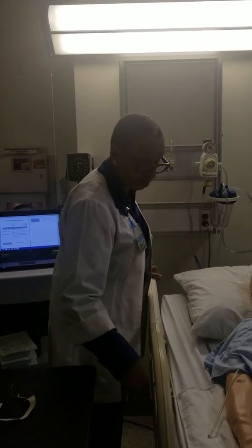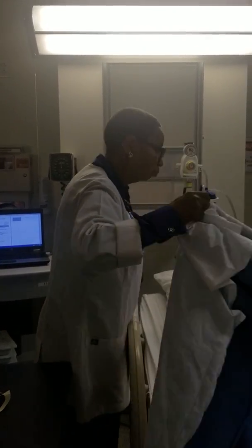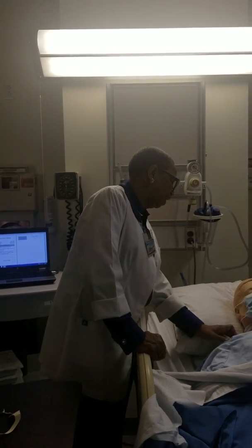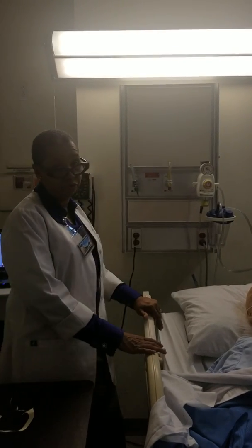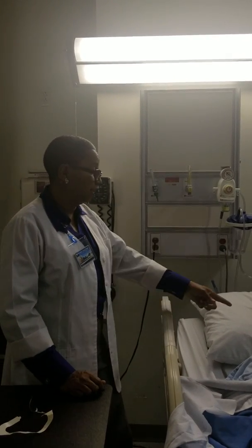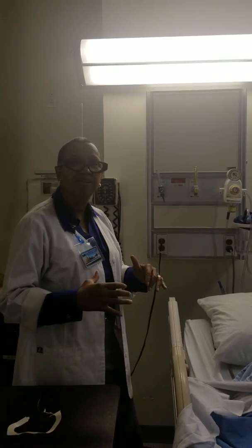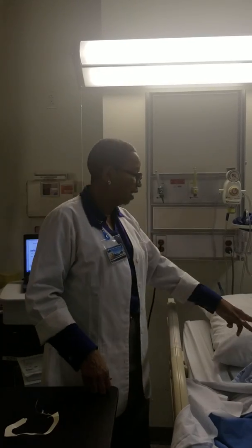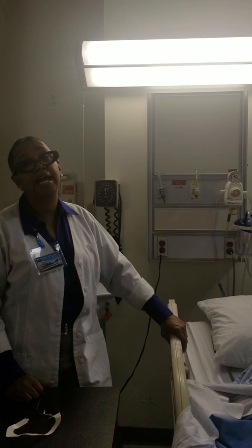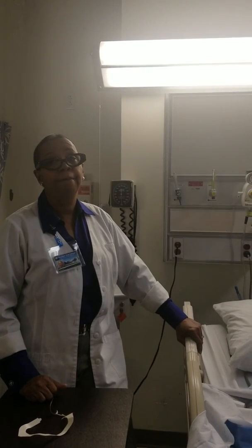What would you use if a person is allergic to Tegaderm or something like that? Well, when they have been allergic, they have used just a gauze dressing, like a 4x4 gauze. But Tegaderm is the only thing that's really going to secure it down tight like that and keep the moisture. Other than that, I've seen them just use a 4x4 gauze. But then you're changing it every day, if not every 8 hours. Well, that's going to be annoying.